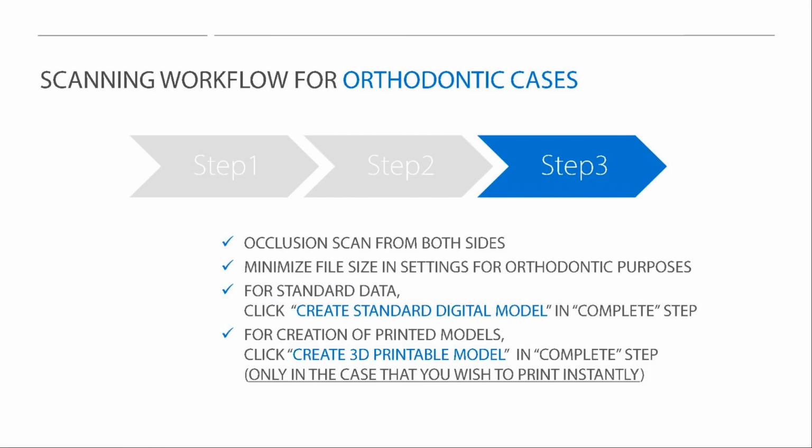And then the last step that we have is the occlusion scan, that we scan from both sides, as I will show you, in order to perform the occlusion. Another important thing that I have explained in the video that I will perform is that you can minimize the file size in order to send it to any ortho lab that is using OrthoCAD, and they will design your restorations digitally. So there is no limitation at all with which lab you're going to work or which software you're going to use for designing your restorations.